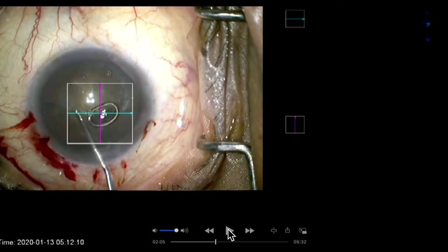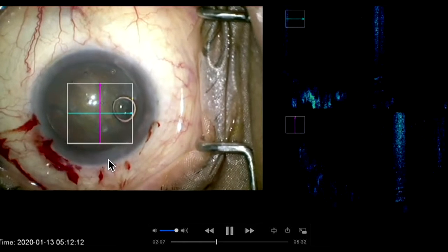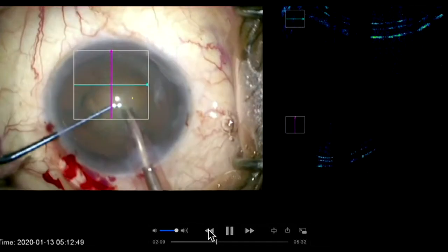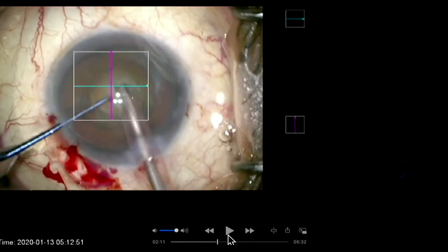The second phase is to protect the endothelium. What I normally do in all cases is inject dispersive viscoelastic first — this is a viscous, oil-type substance. Then I inject cohesive viscoelastic underneath that to push the dispersive towards the endothelium, which coats it and keeps it protected until the end of surgery. Just putting dispersive viscoelastic alone does not adequately coat the endothelium — that is important. So: inject dispersive viscoelastic first, then cohesive viscoelastic subsequently, and then proceed with phacoemulsification.